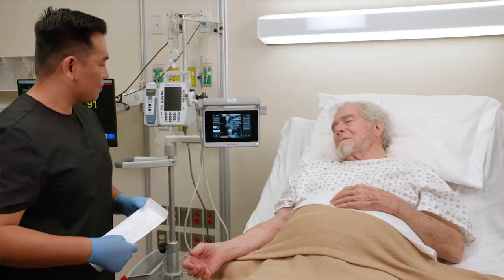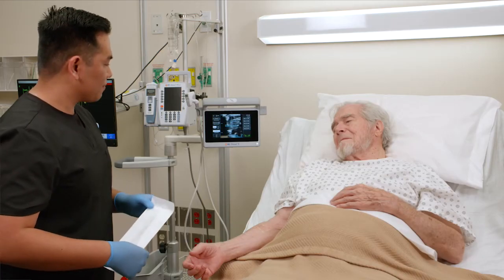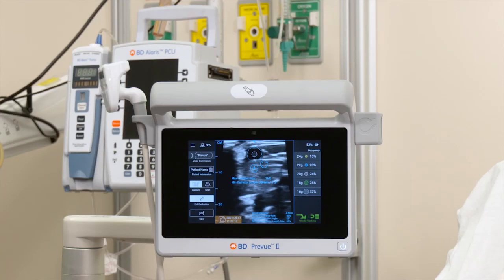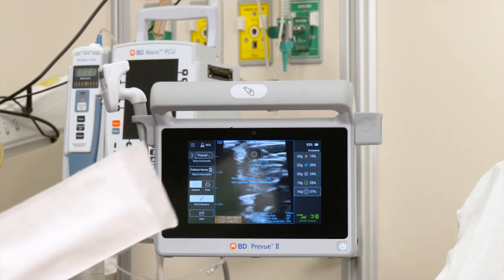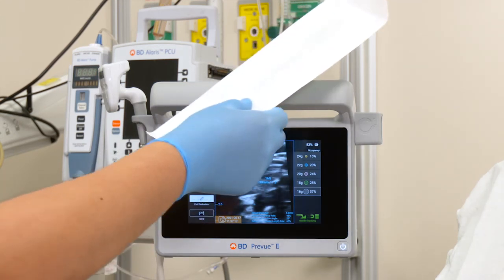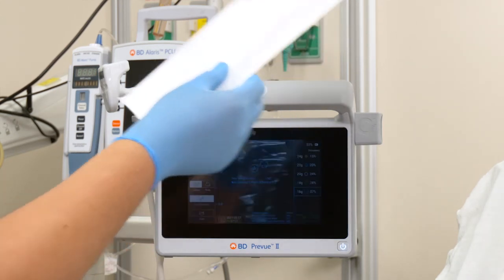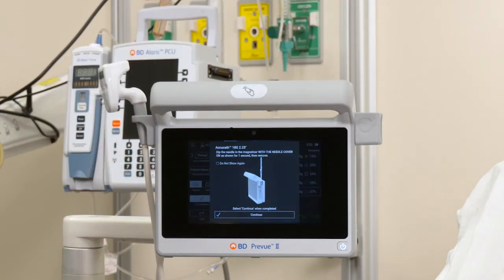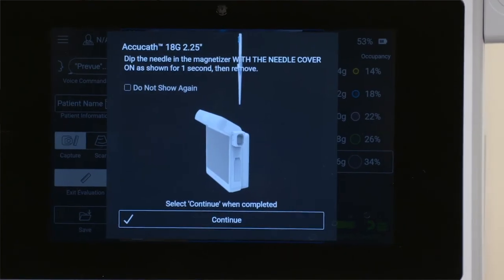If using Q-needle tracking technology, scan the RFID tag of the selected device. For more information on Q, see additional videos.